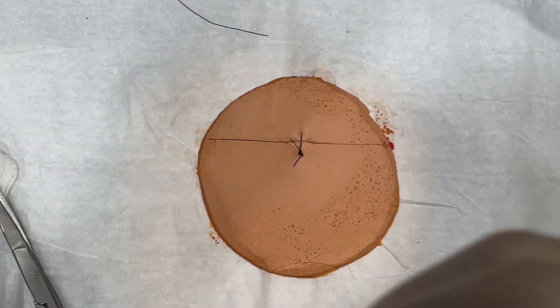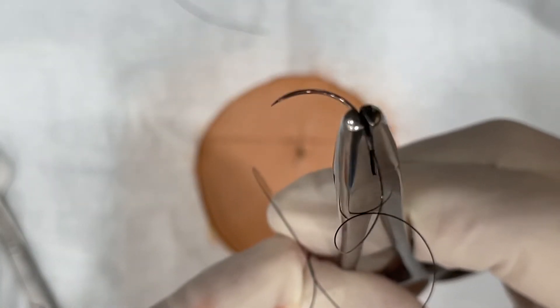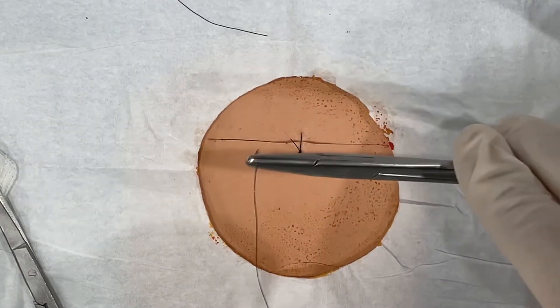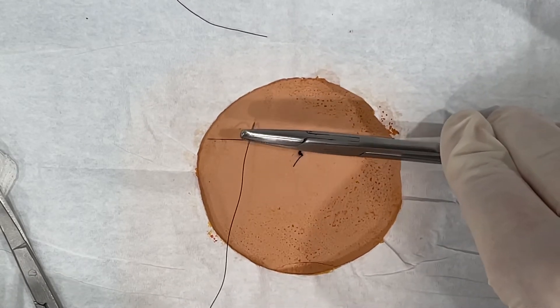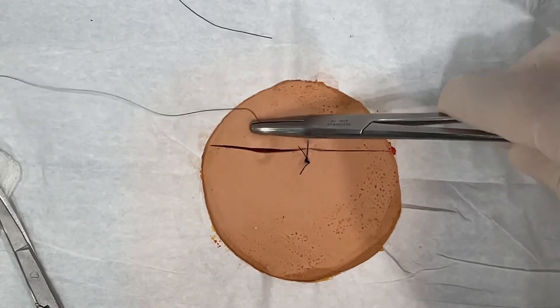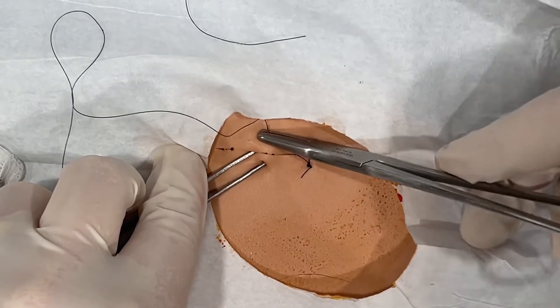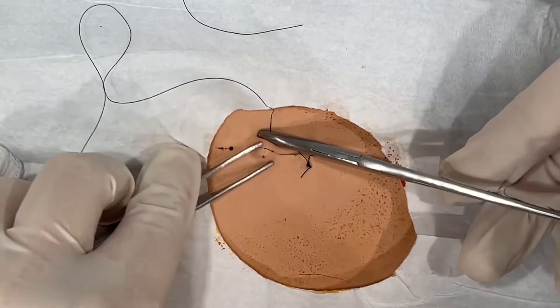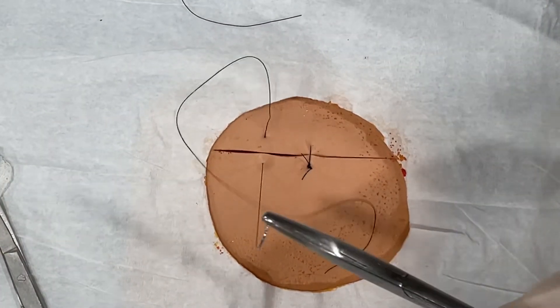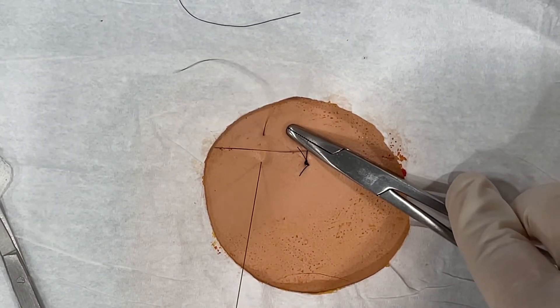Loaded the needle — let me get it in camera. Top third of the curved needle. Go perpendicular to the skin and roll. Just rotate when you go in — that curved needle will do the rest of the work.